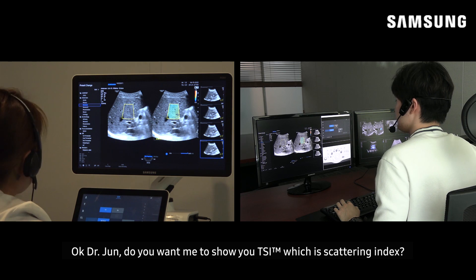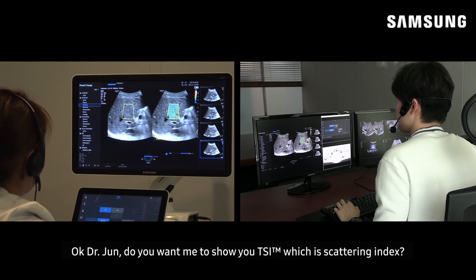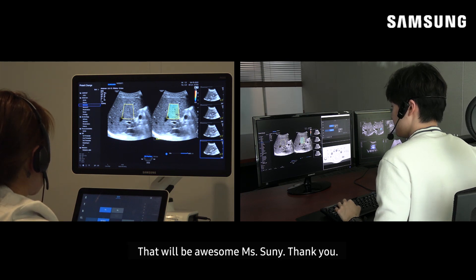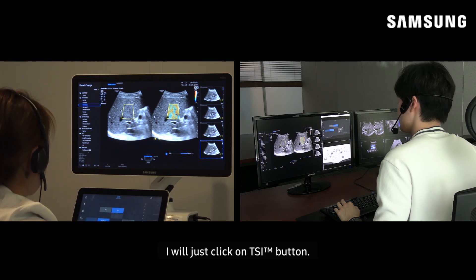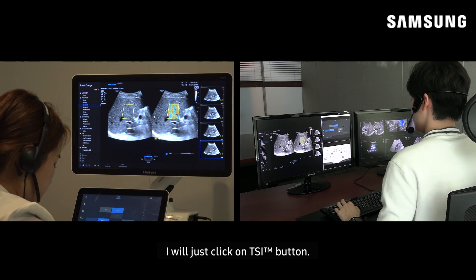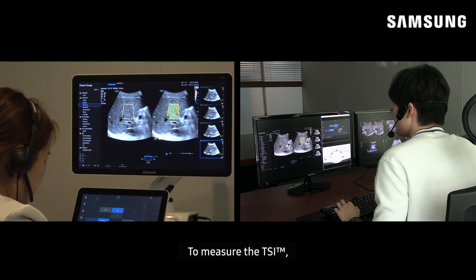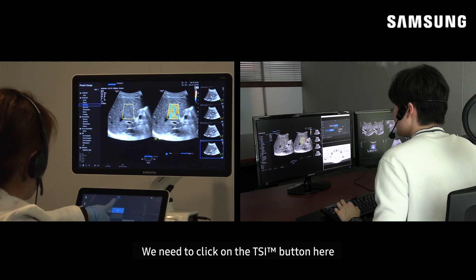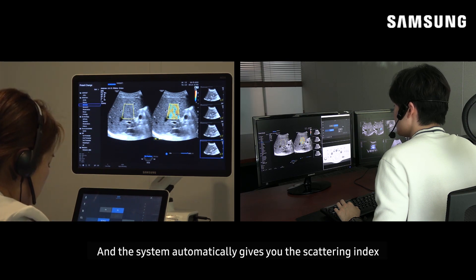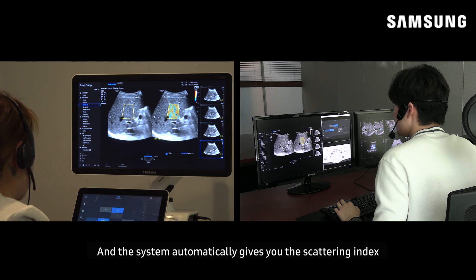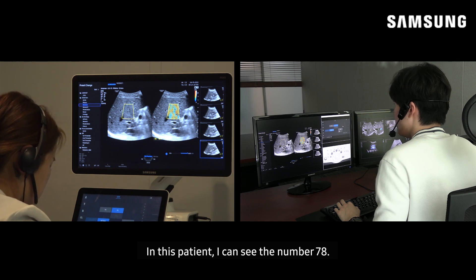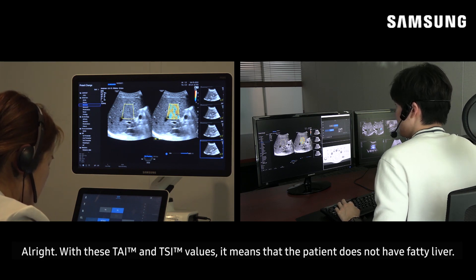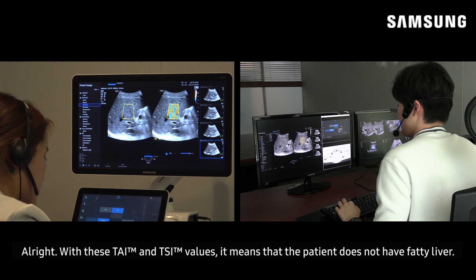Alright. Dr. Jun, do you want me to show you TSI, which is the scattering index? That will be awesome, Ms. Sunny, thank you. I will just click on TSI button. To measure TSI, we need to click on the TSI button here, and then the system automatically gives you the scattering index. In this patient, I can see the number 78. With these TAI and TSI values, it means that the patient does not have a fatty liver.